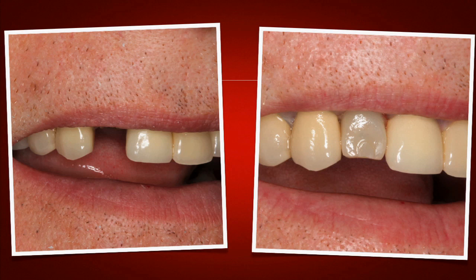As with immediate temporaries, you have to be very careful with your occlusion. The patient was informed in advance that in this scenario we were 100% going to leave this tooth completely out of occlusion — no question that through normal biting and parafunctional habits would he have any touching on this tooth. Obviously as he eats, he's advised to eat softly and to try to avoid site number 7 completely.